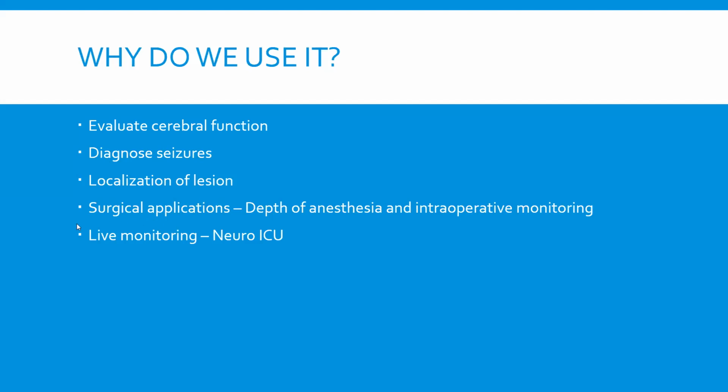And of course, in the ICU, it's also used for live monitoring. In the ICU, we're basically doing checks of the brain every 15 minutes, and it can be very difficult to move a patient from the ICU to get an imaging scan, for example. If we suspect they're having a stroke, or let's say vasospasm, these are things that could happen very quickly. And sometimes if you can't get imaging, it can be shown on the EEG.